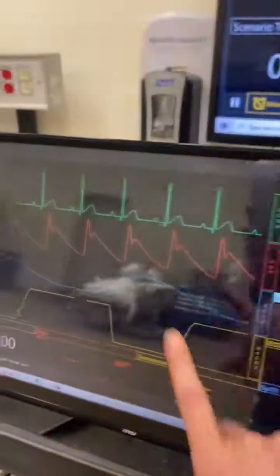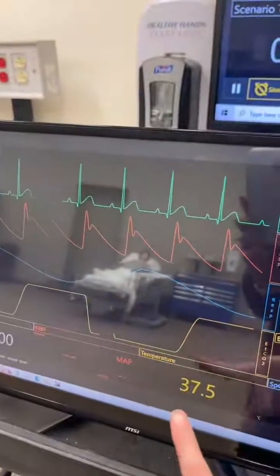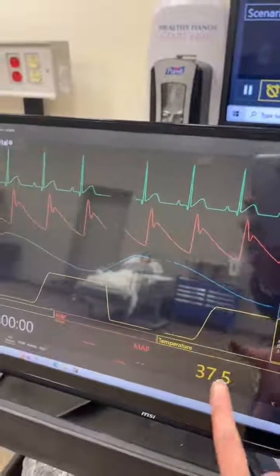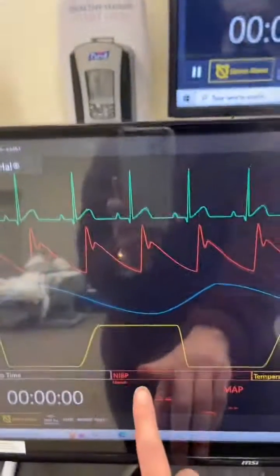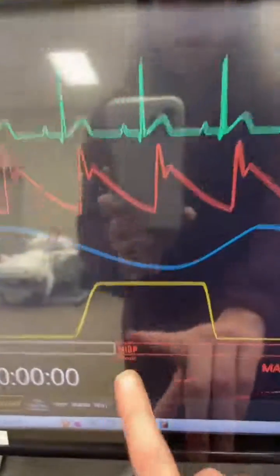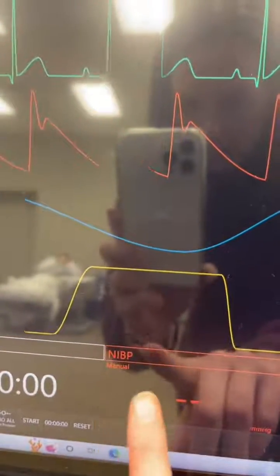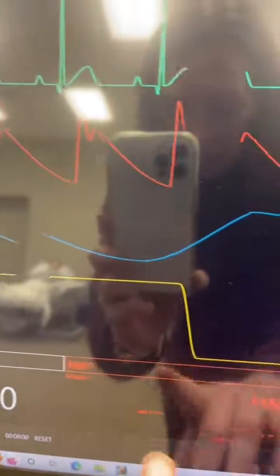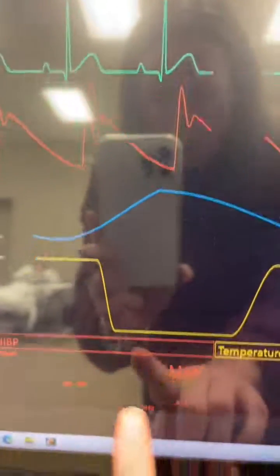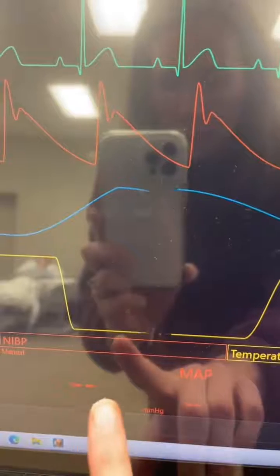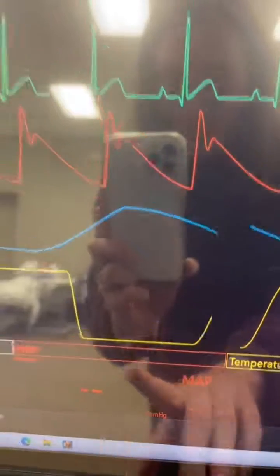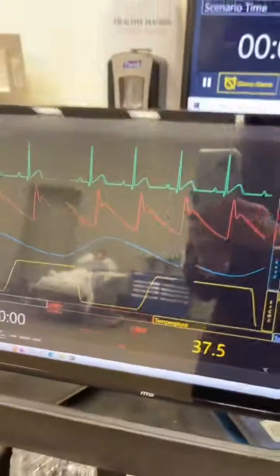This also has continuous temperature monitoring. And on this one, see where it says NIBP — I missed that — it says manual. So if you were to have the cuff hooked up, that manual pressure would come up right there.